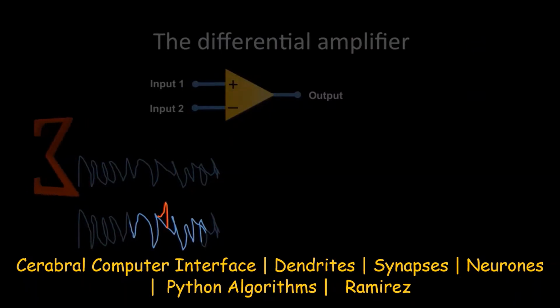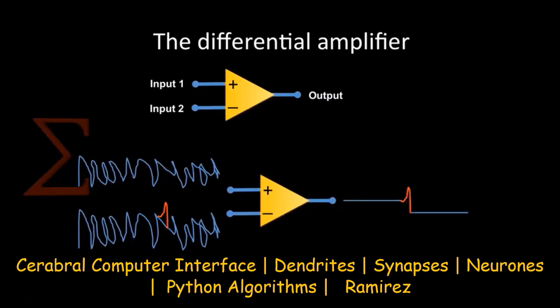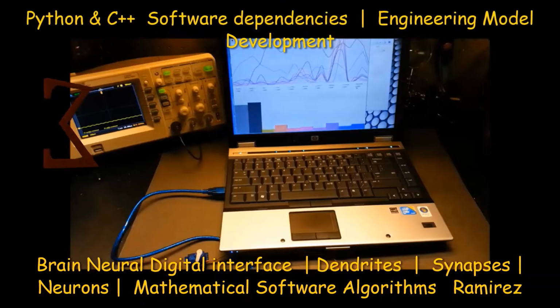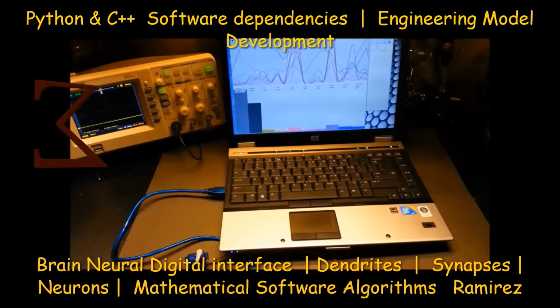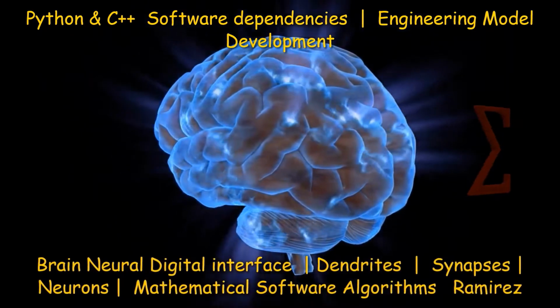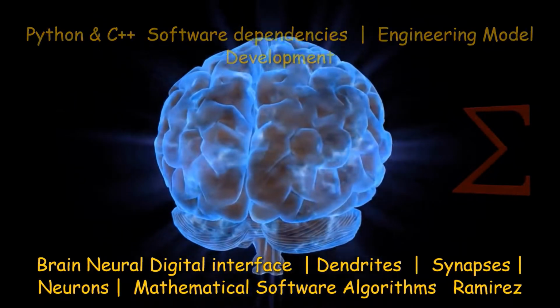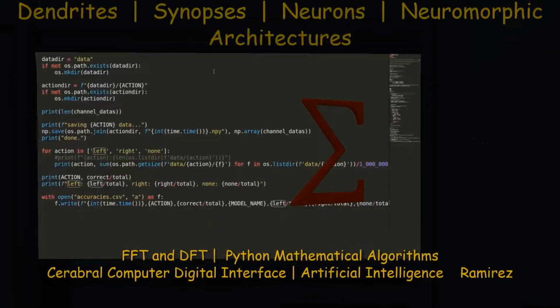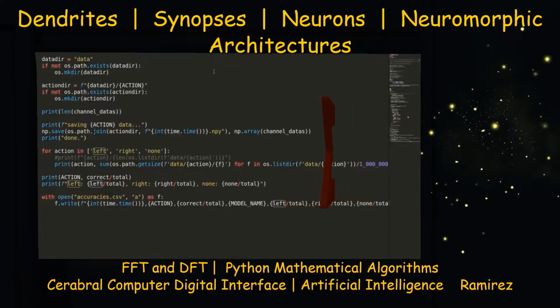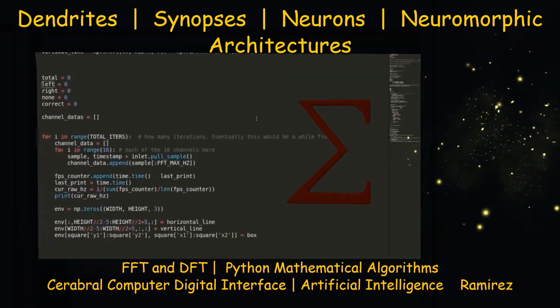It is important to note and to mention that EEG signal processing is built using machine learning. This means the classifier and/or the features are automatically tuned, generally for each user, according to examples of the EEG signal from the user.